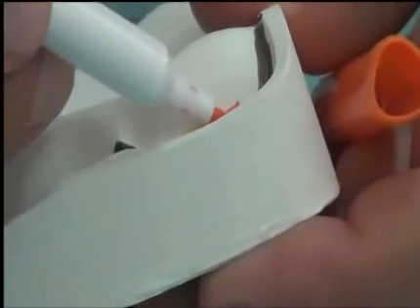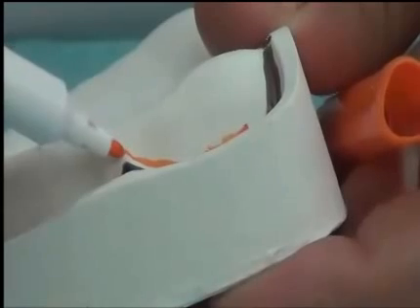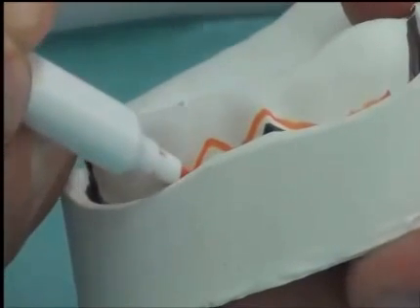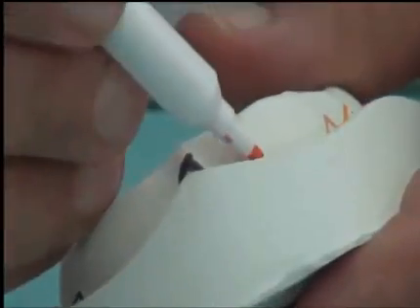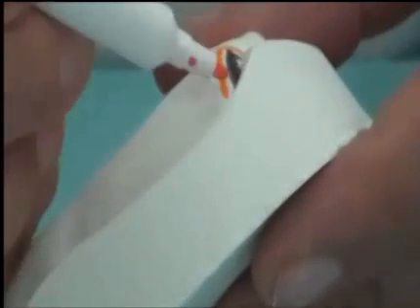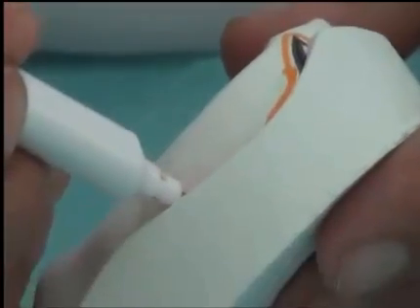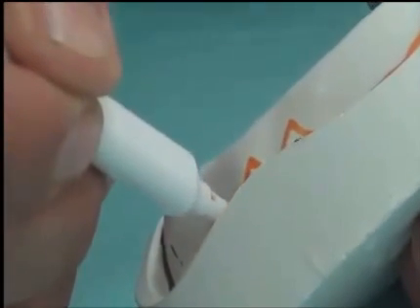2 millimeters to 3 away from the sulcus. And once more we follow the same morphology, so on the freni area we have to make these notches. We follow on the labial area. We follow to the labial frenum. And once more allow clearance for the labial frenum. And to the other side with the same features. Freni notches opposite to the freni in the tissue.